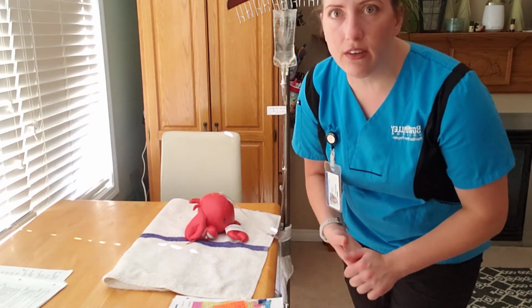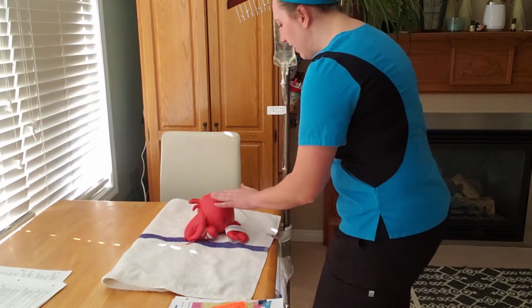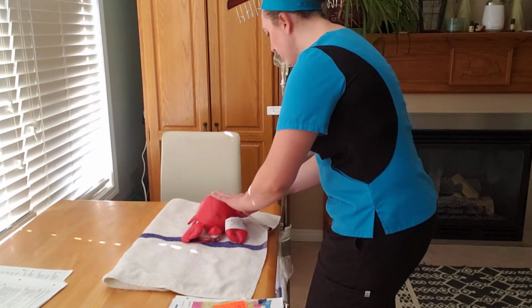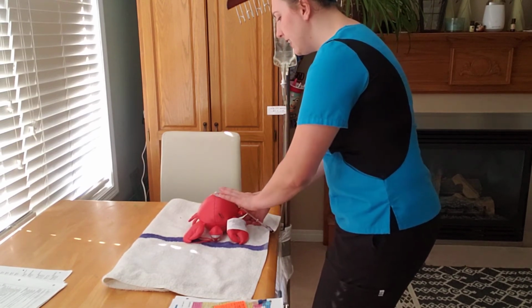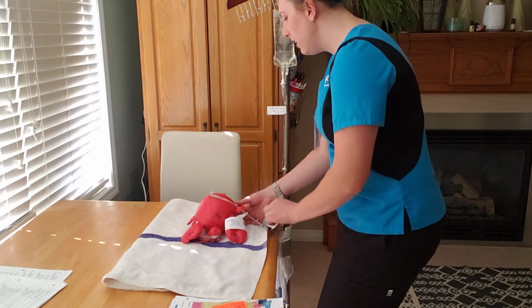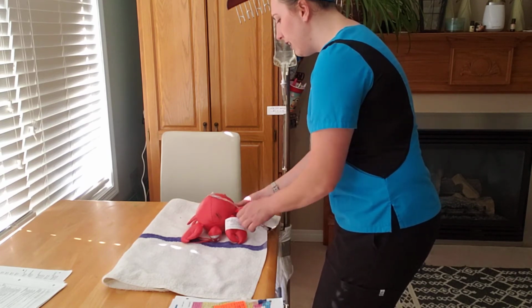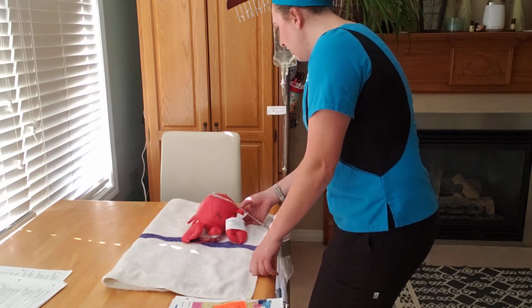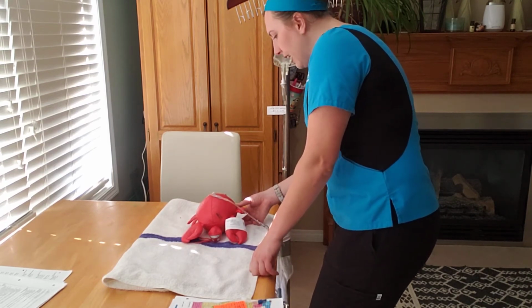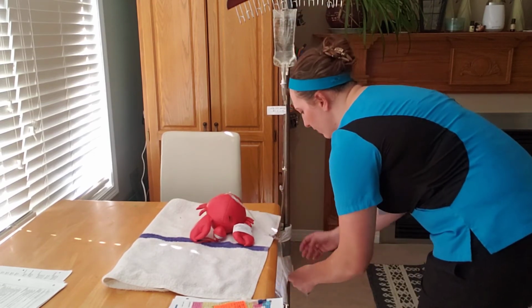So what I'm going to do now is assess her IV site. So Allison, do you have any pain here? No? Okay, so no complaints of pain. It's not tender. There's no swelling. I don't see any vein tracking indicating an infection in there, so that's good. Has this been leaking at all that you can feel? No, and it doesn't look like it's leaking. The line doesn't have any air in it.